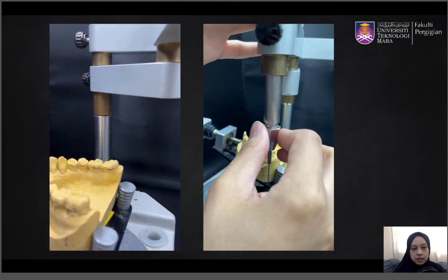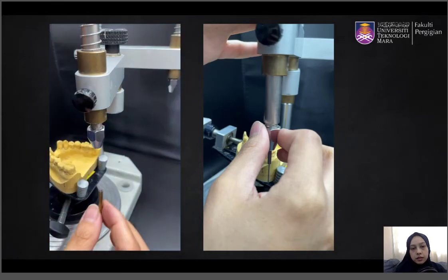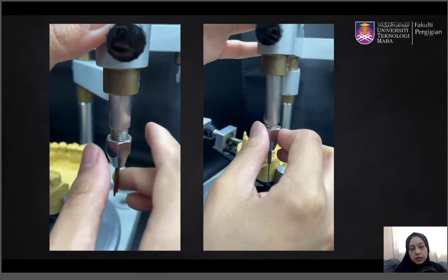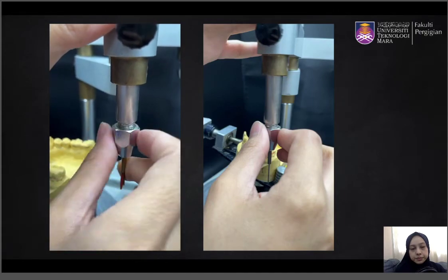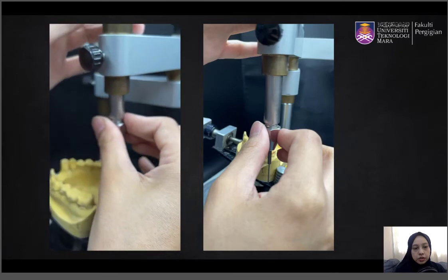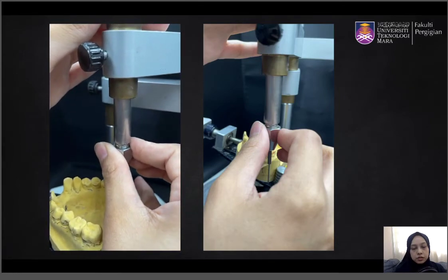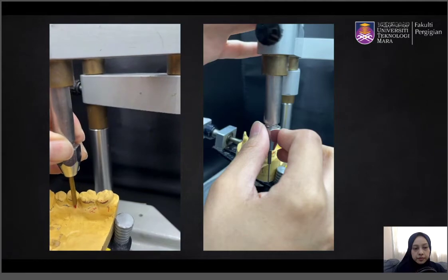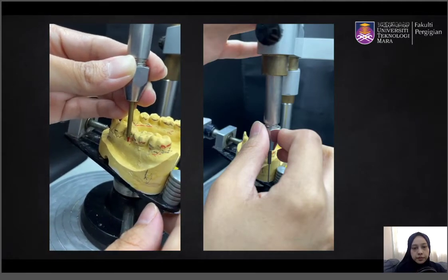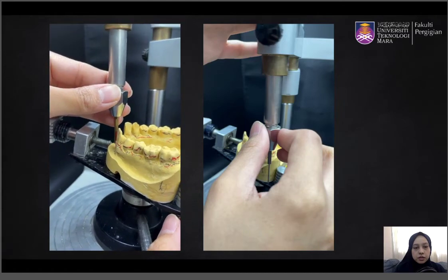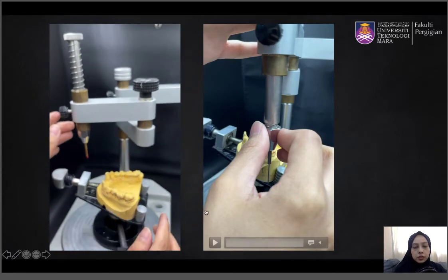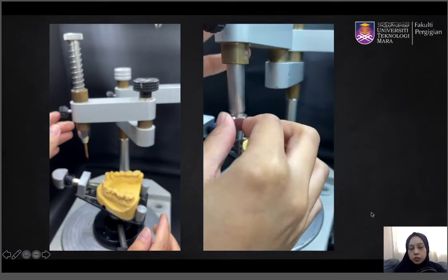Changing the tilt means you are changing the path of insertion. The surveying needs to be done again with a different colored carbon — in this case, a red carbon. Continue and complete the surveying on both the hard tissue and soft tissue areas, then record this new tilt by performing another tripody.